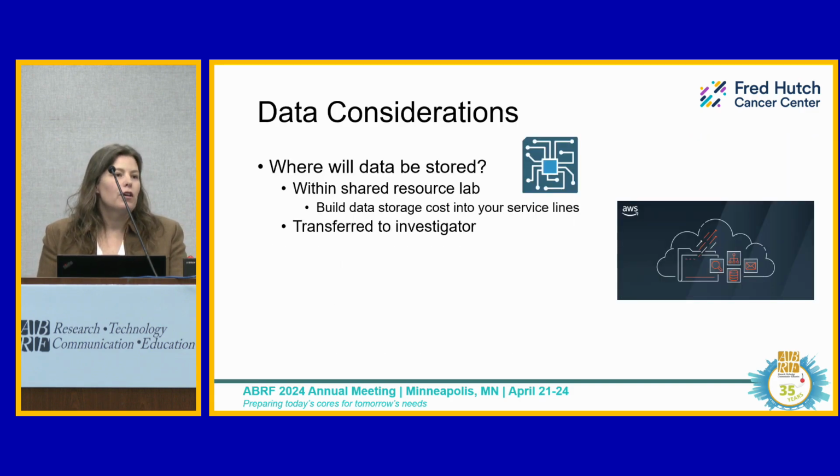Data considerations are a big deal when you're dealing with images. And these images can get very, very large, and storing them is going to cost you a lot of money. So you need to figure out where the data is going to be stored. And if it's going to be stored internally within your core, making sure that you've built a data cost into that service line. Otherwise, you're just going to get buried in paying for these fees yourself over time. You may choose not to store it, and you may choose to transfer it over to investigators. And a lot of people will use local servers for storing data, but more and more folks are looking at cloud-based solutions for some of this storage.